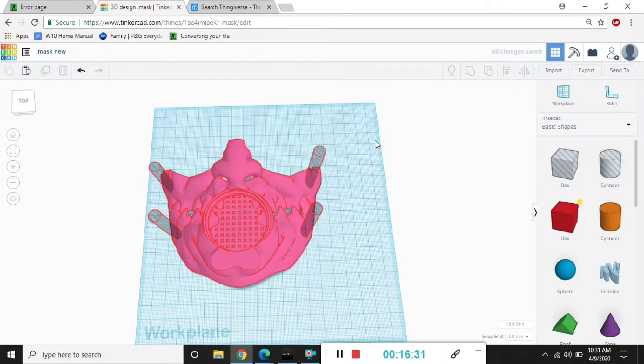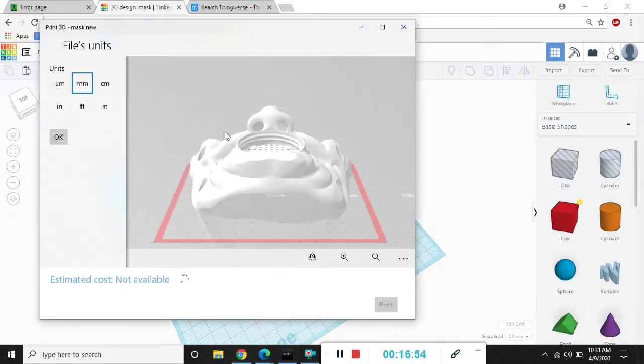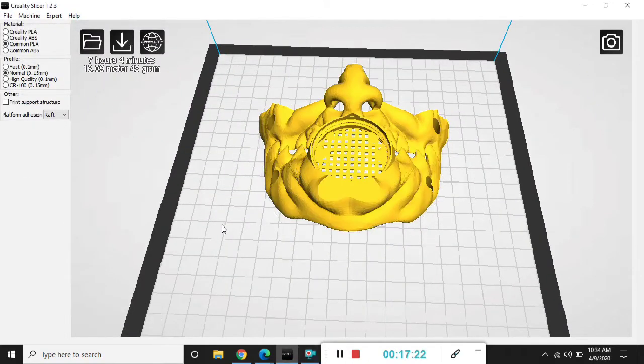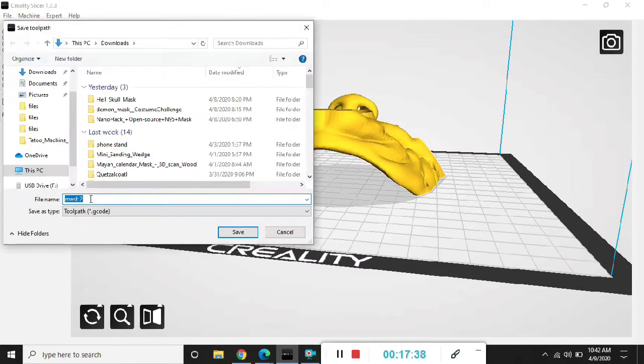After grouping the holes, I'm going to export it and save it as a .stl file. And when I do that, it's going to show an estimated price that they would give you if you were to send a design in to get it printed. And now we're all ready to print.